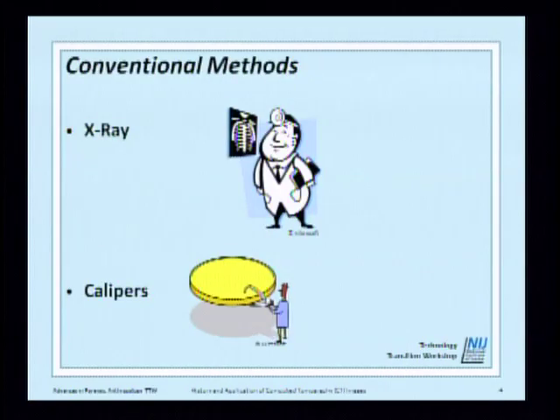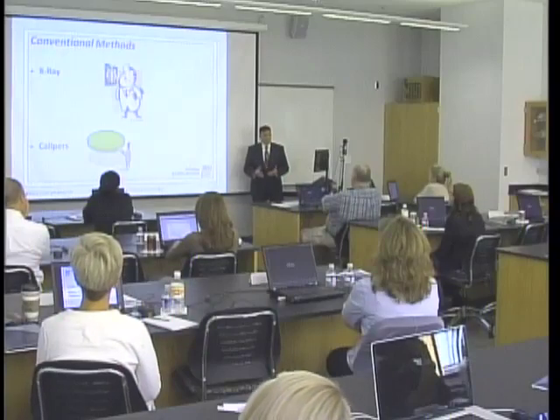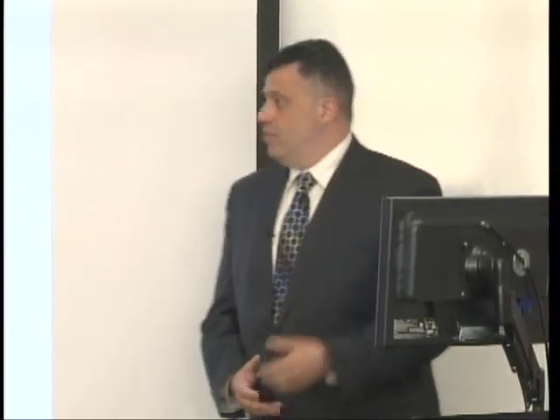So why 3D? Basically, if you look at the literature, and not only in anthropology but also in the implant design and medical device industry, they weren't doing 3D analysis, but things like calipers, or making measurements from X-rays, which was very common. I've seen even early anthropology papers doing a lot of work from X-rays. X-rays come with an inherent problem: a dense object can shadow the structure behind it, and of course there is no depth perception.